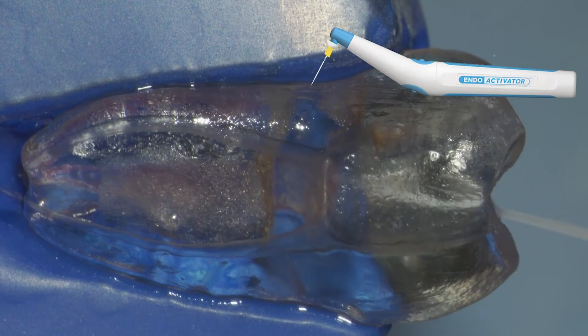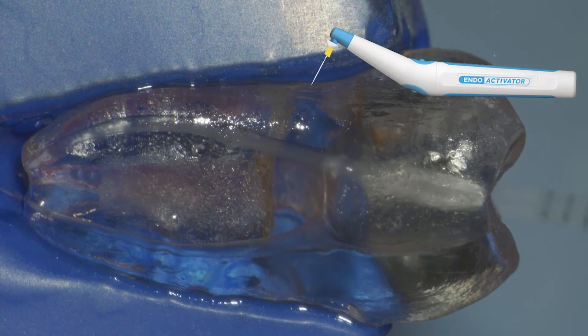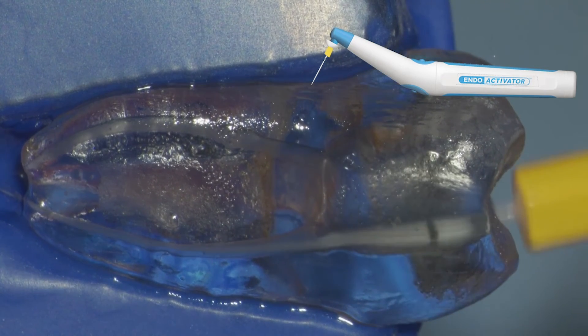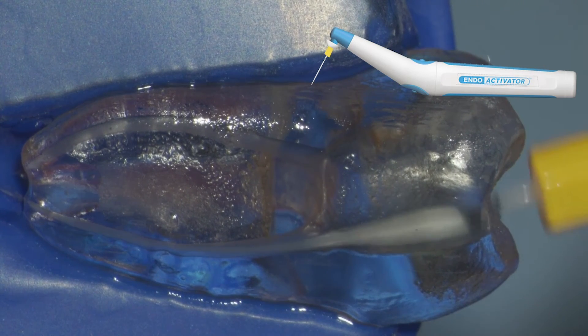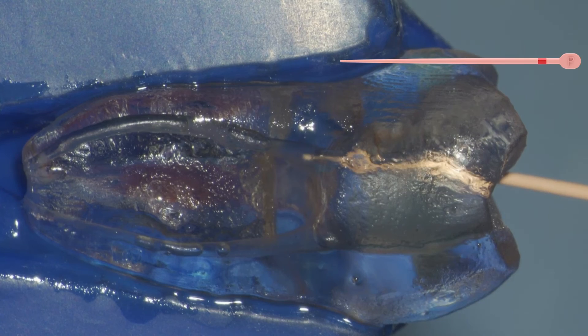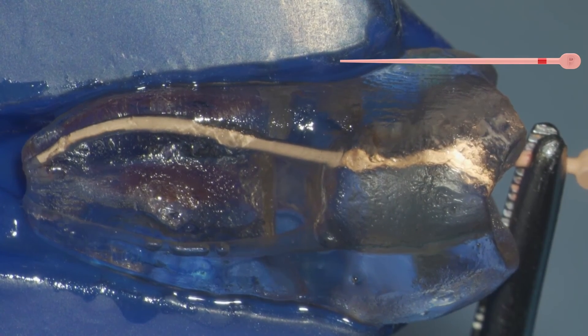Then again, rinse the chamber, irrigate the canal, and activate your irrigants. Follow your disinfection protocols used in your office, then prepare for obturation. One great thing about the True Anatomy irrigation needle with two ports — I recommend grabbing a white plastic surgical suction tip when you're ready to dry your system after using the ConformFit True Anatomy gutta-percha.